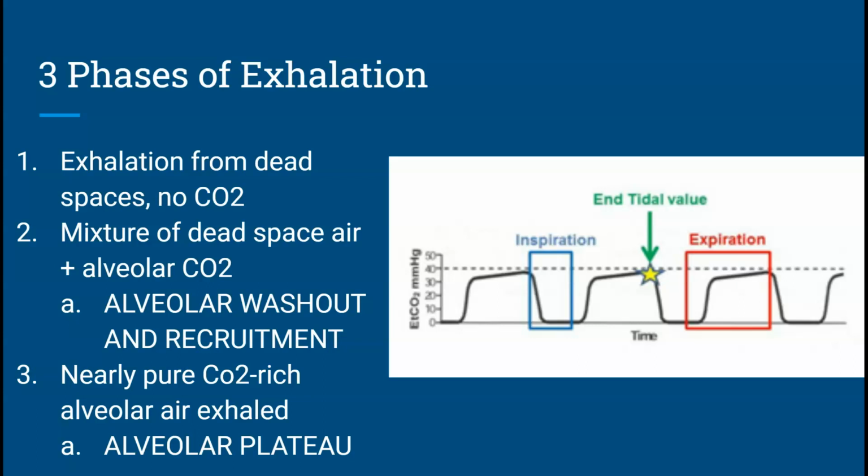So there's a number of different phases of exhalation. When you do start to do this in the skills labs, you will notice that here is 0. When you're down here at 0, it's either inspiration, which is your downslope, because when you are breathing in, the detector isn't going to detect any carbon dioxide because you're moving it in the opposite direction.